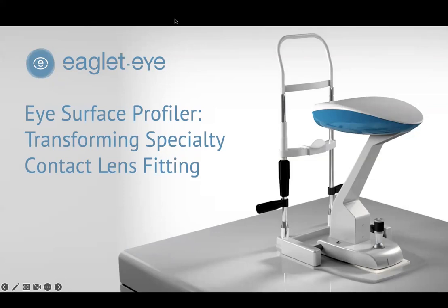The title of the webinar is the Eye Surface Profiler, Transforming Specialty Contact Lens Fitting. Many of you are probably familiar with the Eye Surface Profiler as being something for scleral lenses, but it's not anymore. If you've kept track of us, you've seen that we've added first lens fit algorithms for many different kinds of lenses, and it's a device that really serves the entire contact lens spectrum.